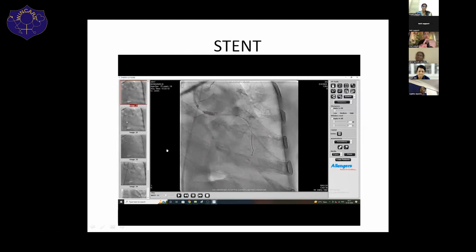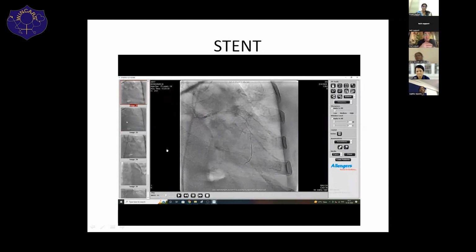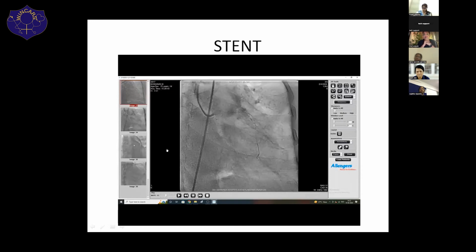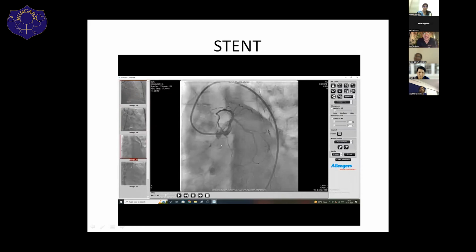You used the cutting balloon, you knew that your LCX ostium was okay, so you could go for a provisional strategy. In this kind of scenario, let us suppose you have heavy calcium and you need to modify that. The safest bet would be to put an IABP, take 2 wires, and use IVL if required, because with IVL you have the option of putting 2 workhorse wires, and you can work anytime on that. That is my personal favorite modality in case of bifurcation lesions. In those cases, we don't go for 10 cycles in a single go. We give 5 cycles, 5 pulses per cycle.